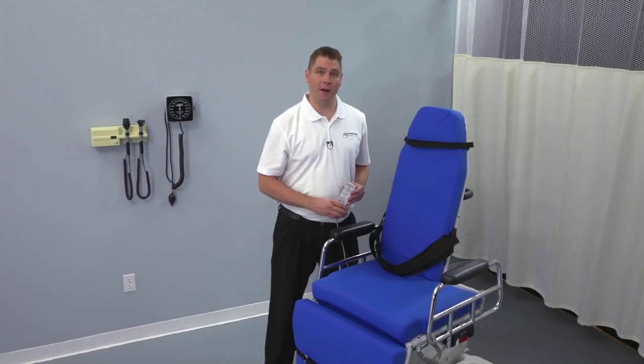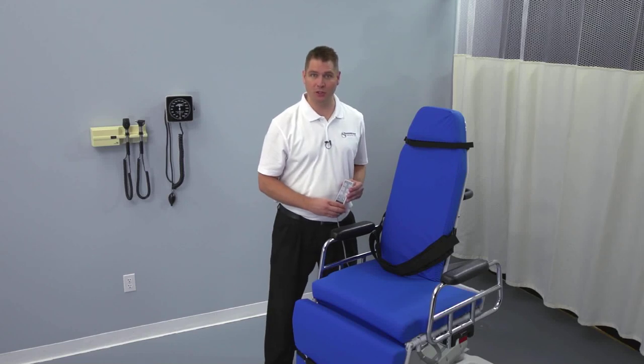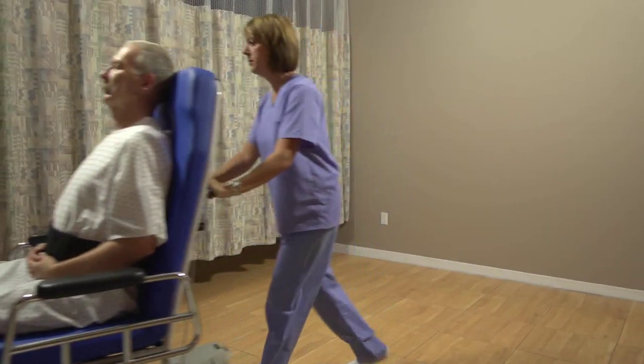The hallmark of every TransMotion chair is its exceptional motorized patient positioning. Using the handheld pendant, you can take your patient from supine to upright and everywhere in between.